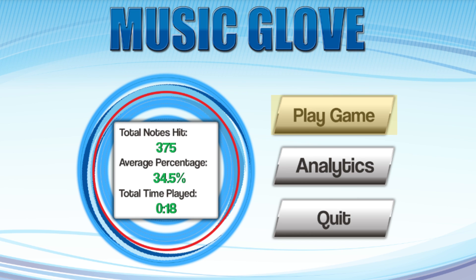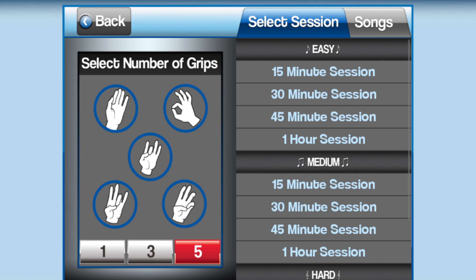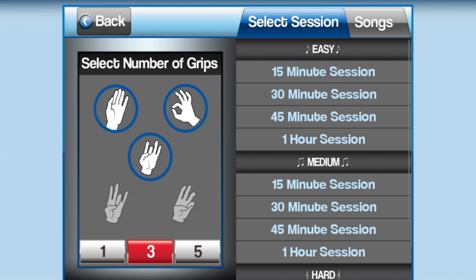You should now see the MusicGlove main menu screen appear. Select Play Game to go to the Game Options screen. On this screen, select the buttons labeled 1, 3, or 5 on the left to change the number of active grips that will appear in the song. Select Songs to view individual songs from the list, or Session to view the session selections. Select any session or song on the list under the desired difficulty to start the game. We recommend starting with a 15-minute session, found under the Easy header.